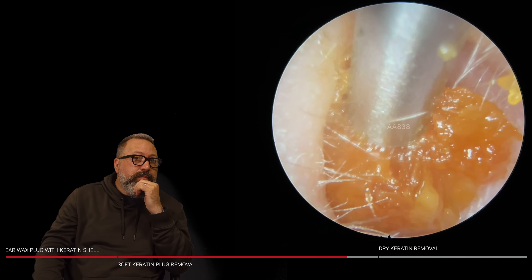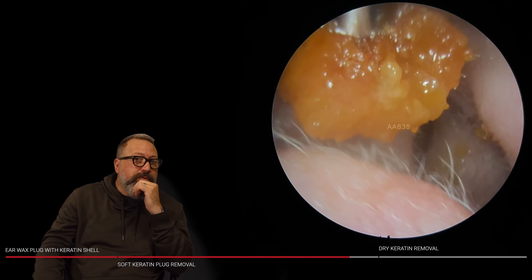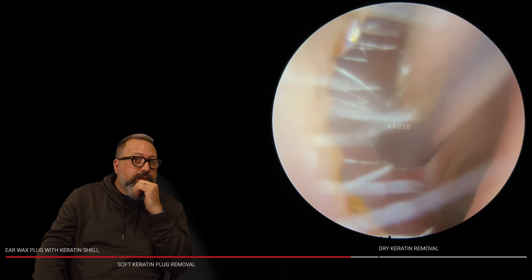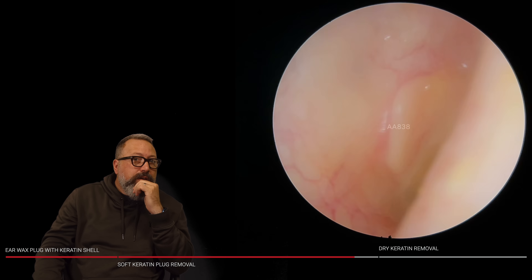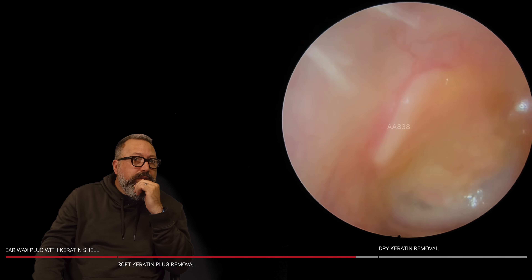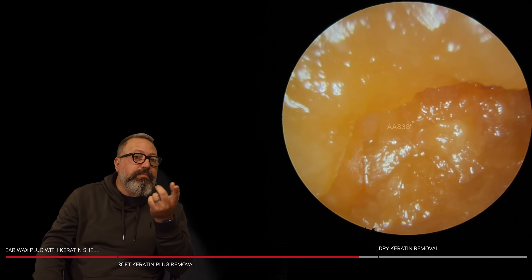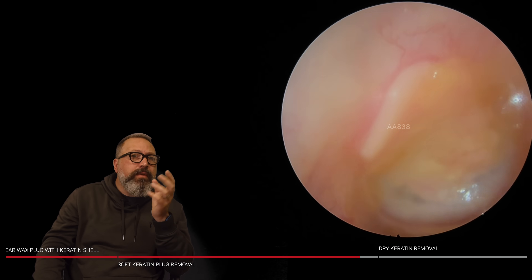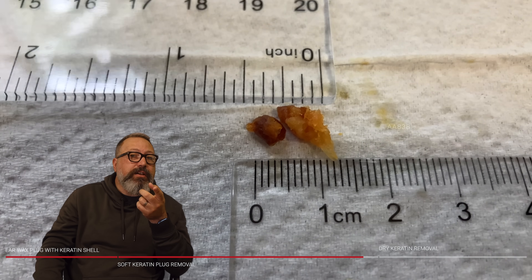Let's give this a little bit of a wiggle. It'll be interesting to see this eardrum beyond. You can see there's a lot of scarring there at the top — it really wouldn't surprise me if that was a tympanoplasty. So this is what came out — just over a centimetre, half an inch there.